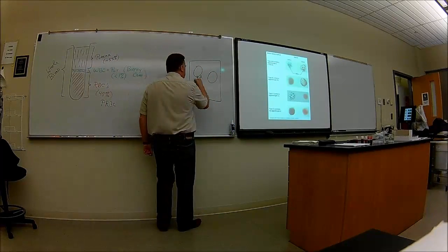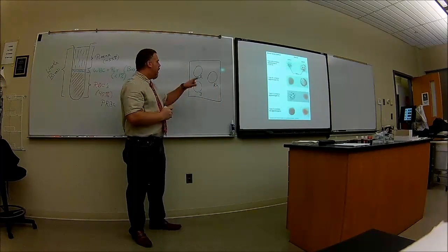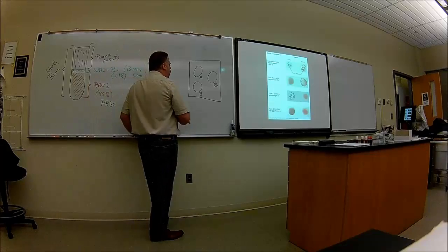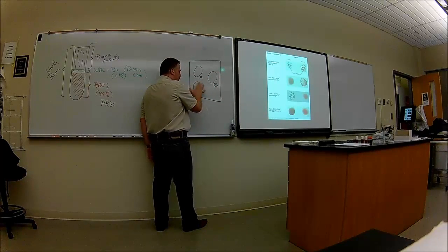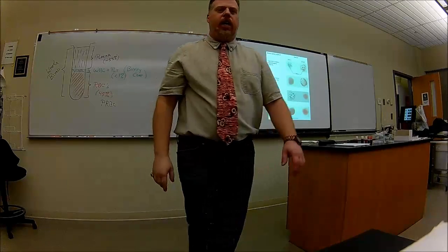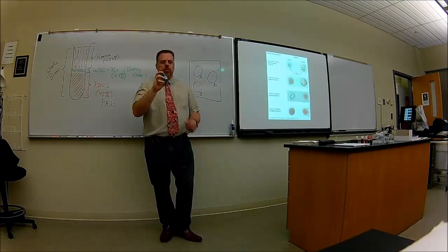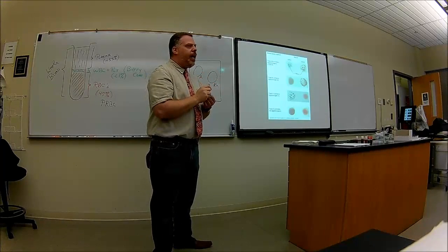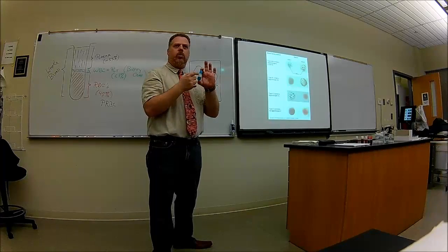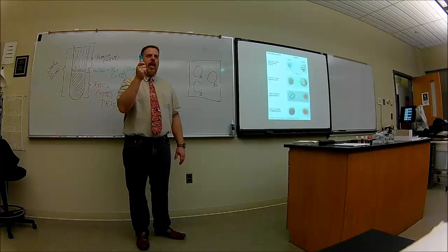So if you have a tray with 3 wells on it, it should read something like that, right? A, B, and RH. Do you have that? Okay? On the same page? Now, let's forget about RH for a moment. In fact, let's forget about B for a moment. Let's just talk about this well here. Now I also put on your table these liquids, different color liquids. It'll say anti-A, anti-B, anti-RH. These are actually liquids that contain antibodies to that corresponding letter that's on the bottom. So anti-A, this is antibodies to A.